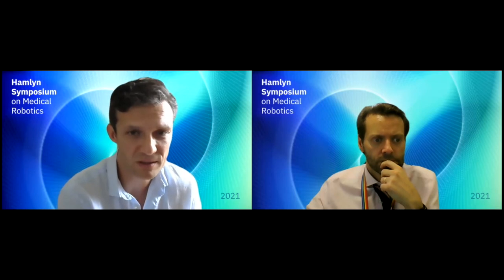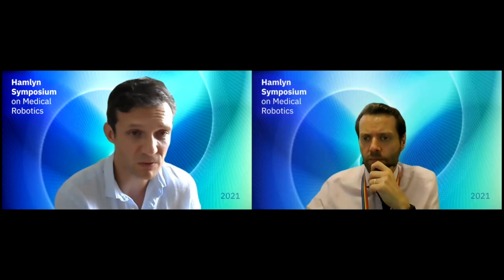In the multitask approach, 3D and segmentation, how would you evaluate disparity estimation performance, and do you have ground truth? Right, yeah, so we've been evaluating using the two data sets that I mentioned. So one of these is the SCARED data set, which was released by Intuitive. I think the paper is now live on arXiv, and the data is available for download. So that contains quite a few sequences, and it does have ground truth. It's got some problems occasionally with it, but it's one of the best data sets out there.